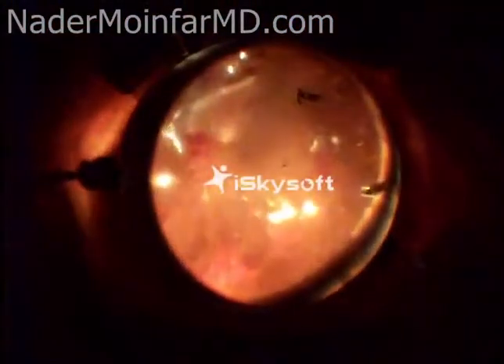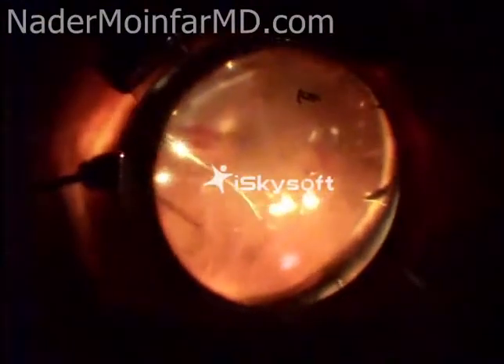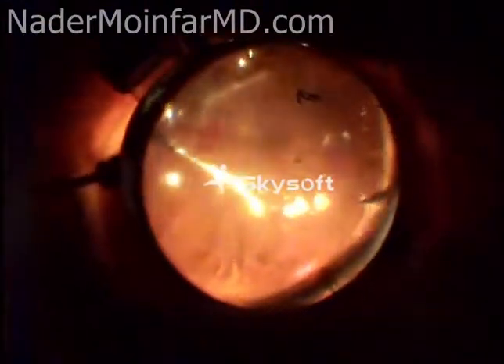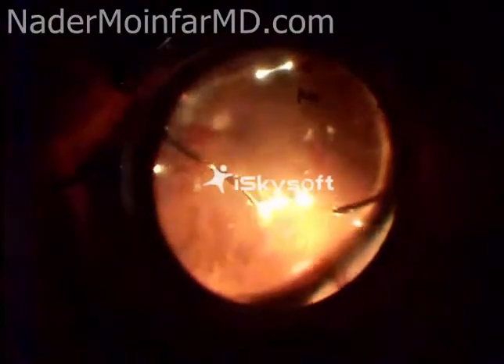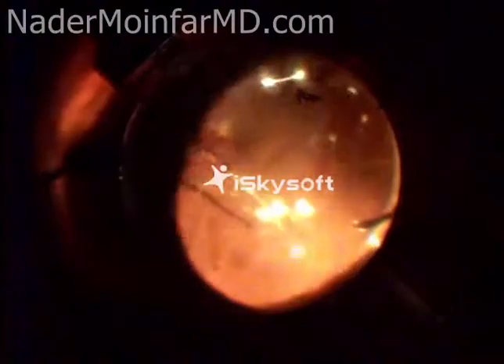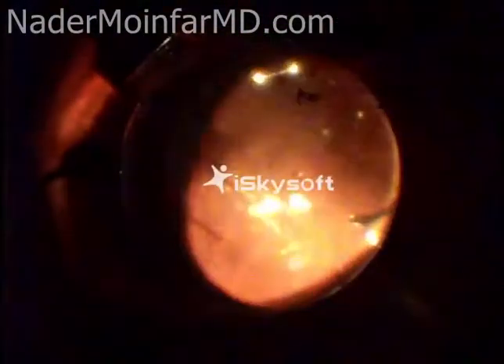This laser probe is attached to a laser machine that delivers laser spots to the retina, which you will see as green lights that leave a white spot on the retina.